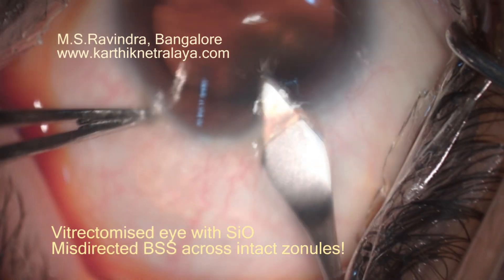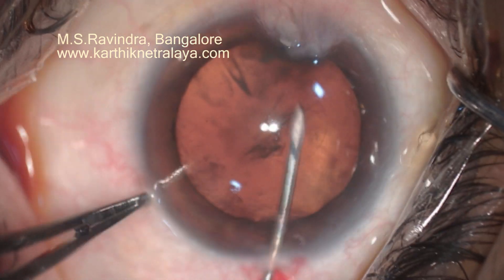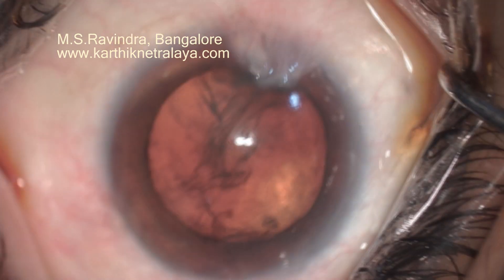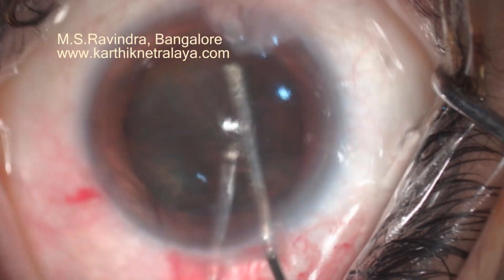This unique video shows the fluid misdirection during surgery — a very rare capture of an image. There is a 2.8 millimeter translimbal keratome entry, CCC followed by hydro dissection.